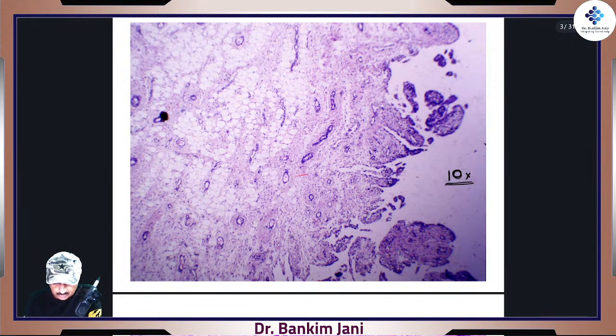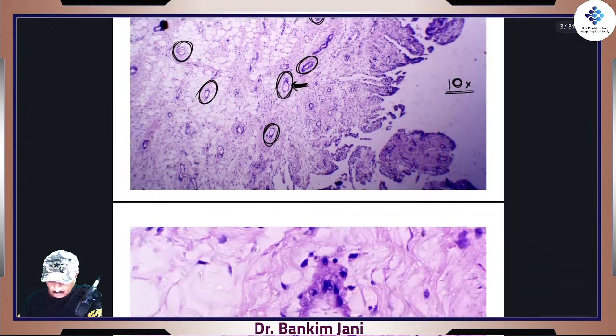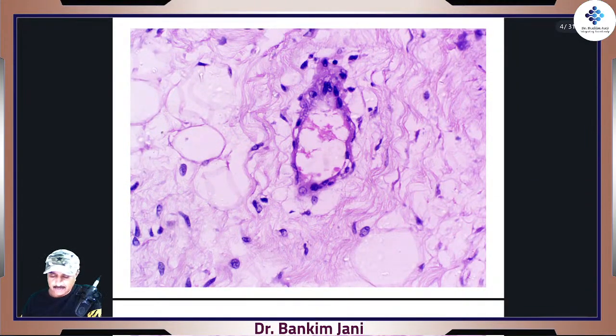Watch for this small structure, right? Watch for this, watch for this, watch for this. These are all arterioles, see? But they don't look that appealing, because the magnification is less. Let's zoom in. We move on to 40x. See now how beautiful it looks. This is 40x.